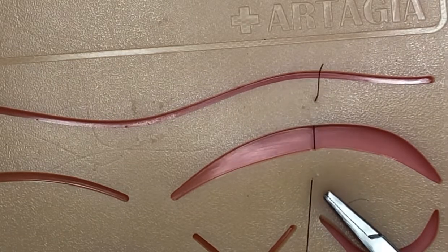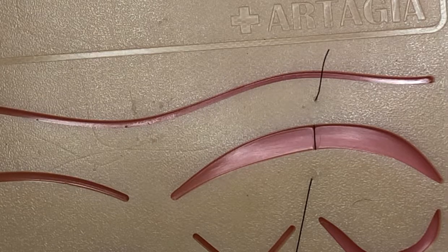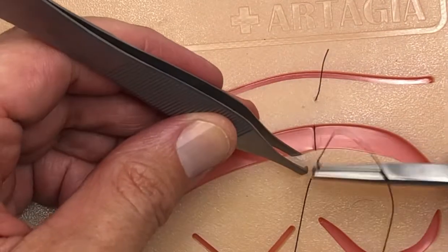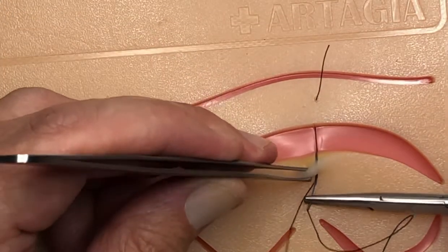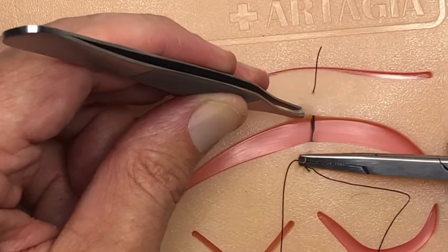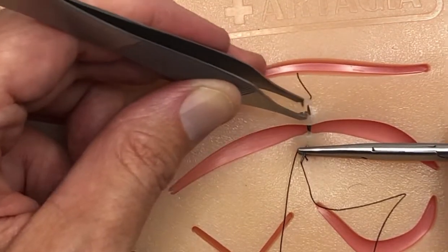I'm going to pull the tail down so we've got a little bit to tie with. Then going in the opposite direction, we're going to do the near-near. I'll use my tissue forceps to grab, doing near and a little bit more superficial — you can see that right there — and then come through and do the near.